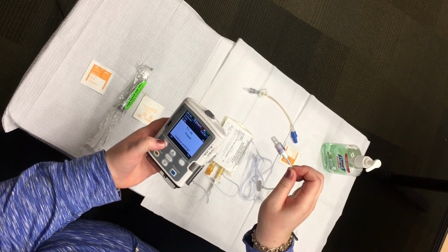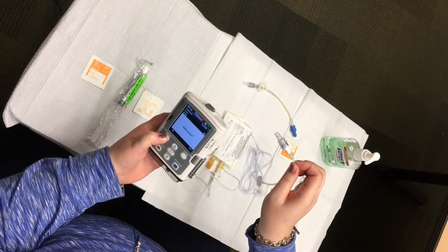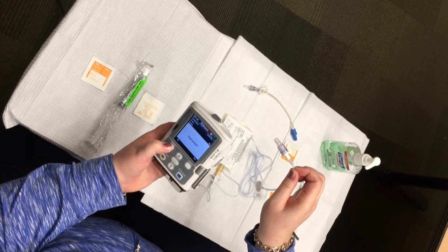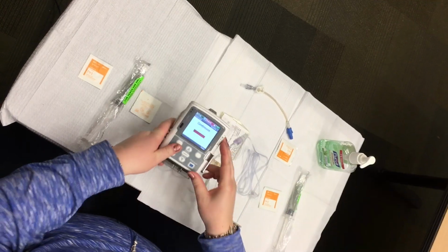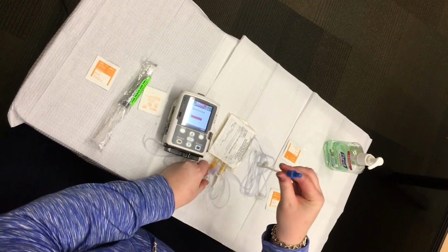The pump will ask you if you want to continue priming. Press the white button under no. Then it will ask you if you want to start the infusion. Press the white button under no. You are now ready to connect the primed IV medication tubing to your family member's IV access line and start your infusion.